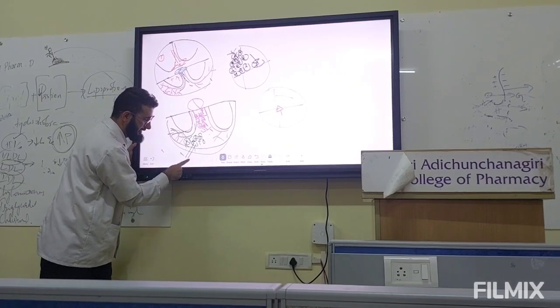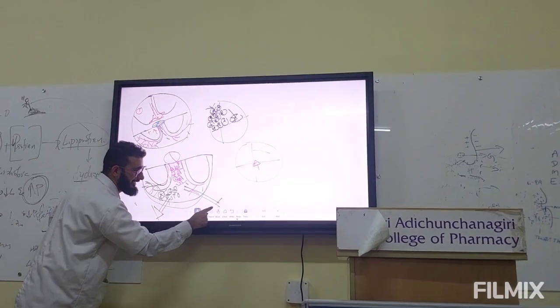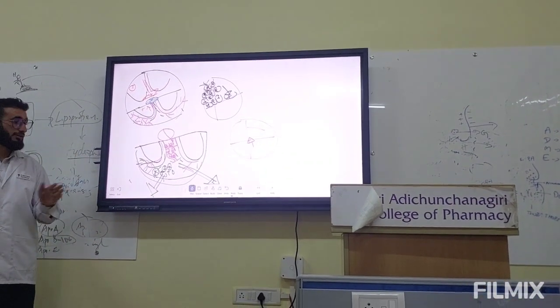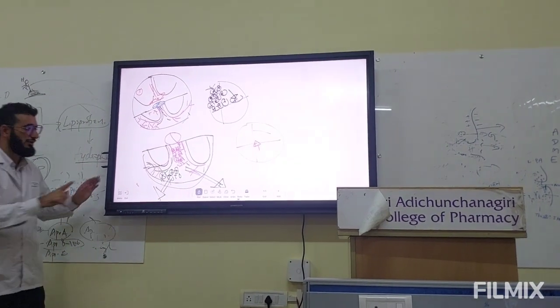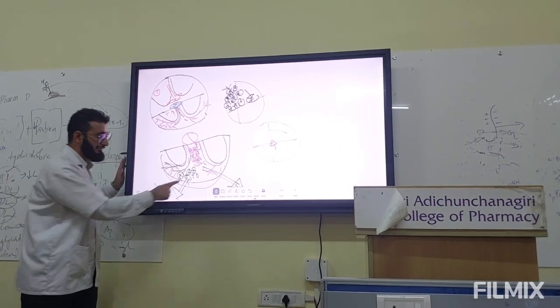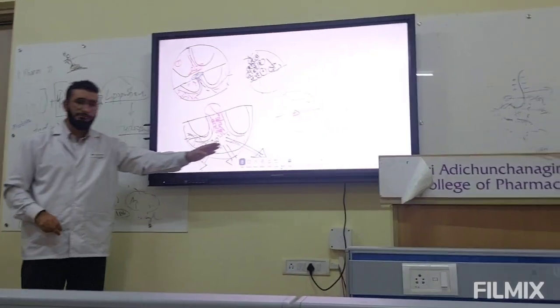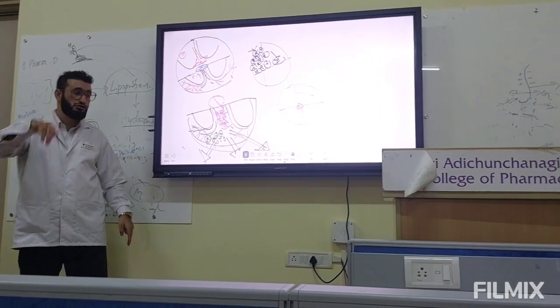The direction is like this, and on the right side the direction is like this, towards the opposite side. So these vectors can be represented by a single vector. When we take the summation of the vectors, these two can be represented by a single vector carrying positive charge towards its head, towards downward.